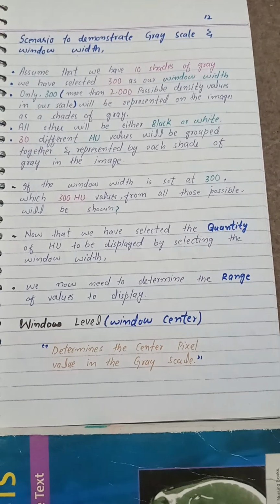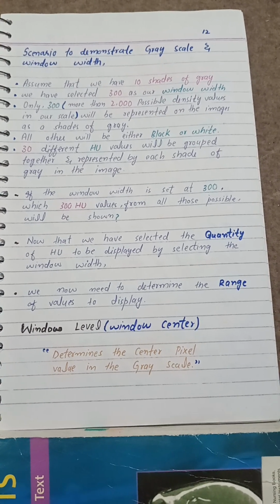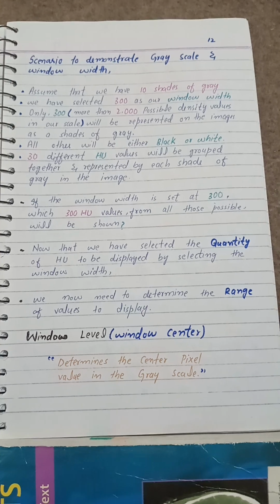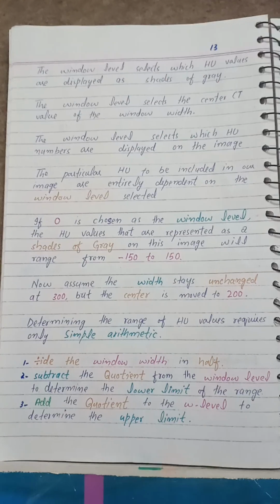Now that we have selected the quantity of Hounsfield units to be displayed by selecting the window width, we need to determine the range of values to display. Window level, or window center, determines the center pixel value in the grayscale.